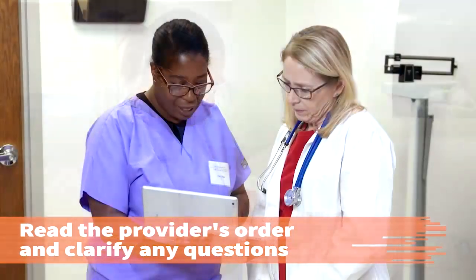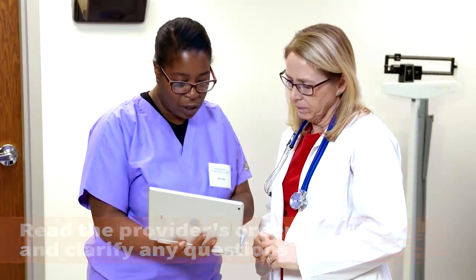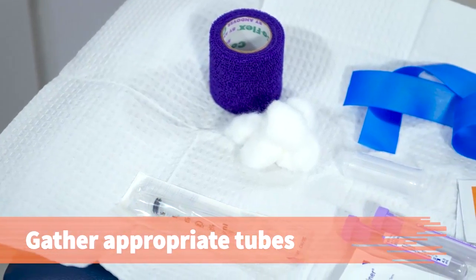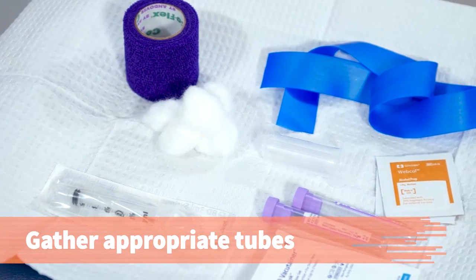Read the provider's order and clarify any questions with the provider. Gather the appropriate tubes, as specified on the requisition form, and all other required supplies.